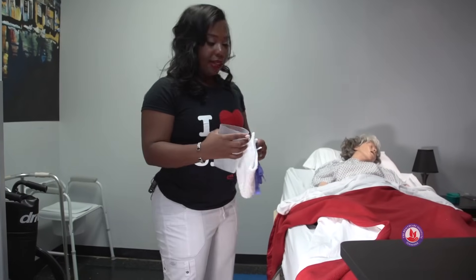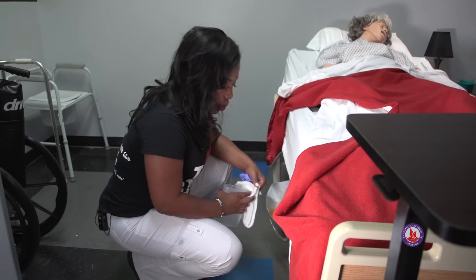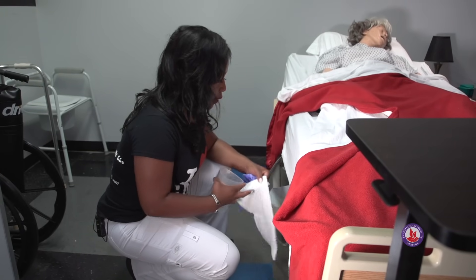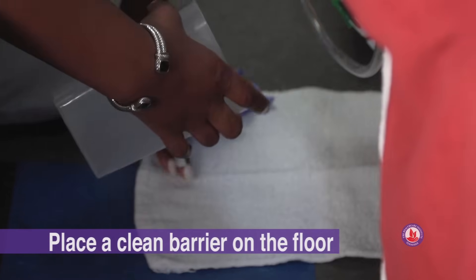We've gotten our supplies. Now we're going to kneel down to empty the urinary drainage bag. You never want to put your knees on the floor or sit on the floor — just kneel on your feet. We're going to place our barrier on the floor under the drainage bag.